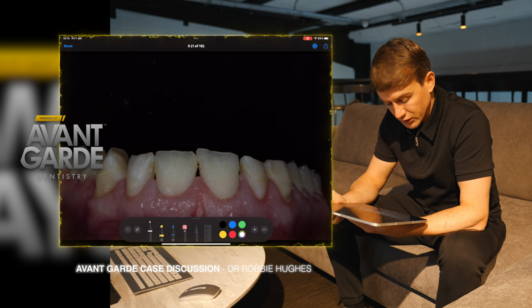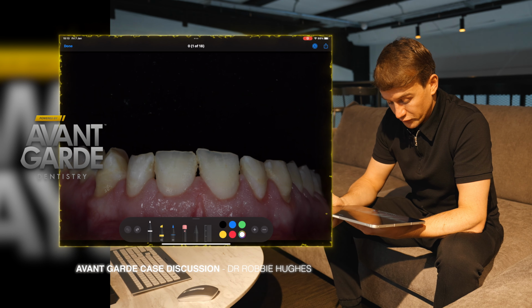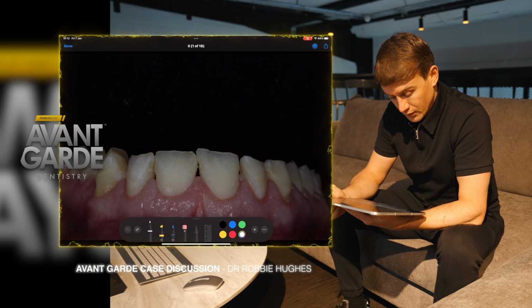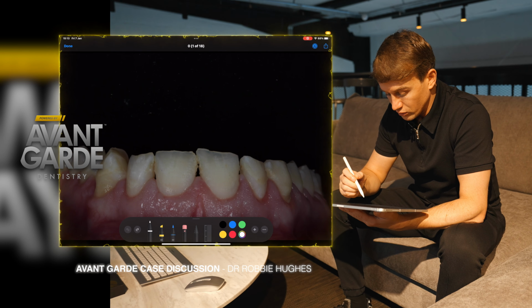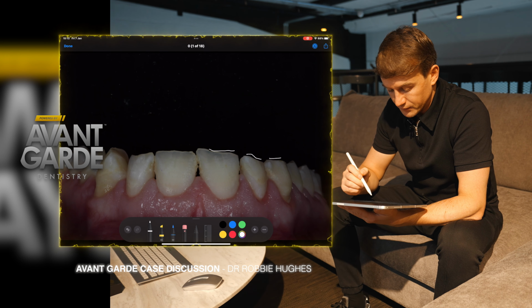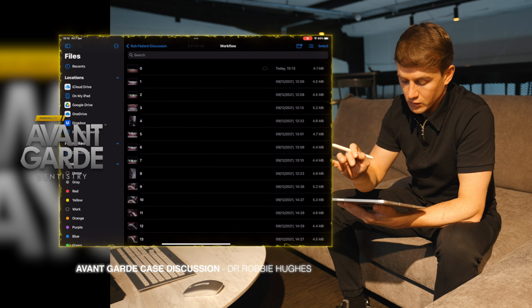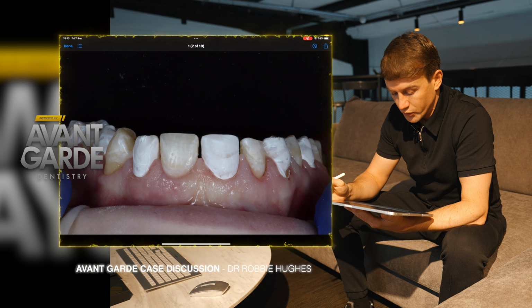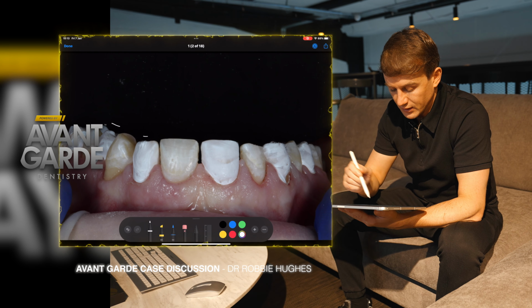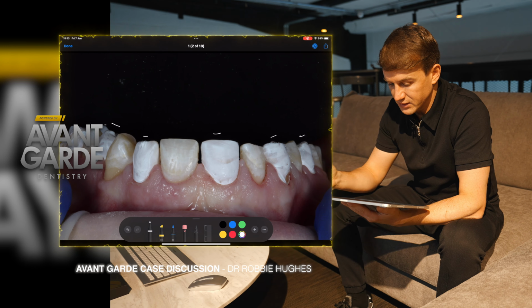You see the gingival condition is nicely healed and the tooth proportions are starting to take shape with the crown lengthening completion, but we've still got, you know, the wear and the tooth shapes to improve, which you've seen that improvement through the mock-up. So first stage is what we call stage 1 isolation, where we isolate every second tooth out of the 10 that we're going to treat with some PTFE tape.